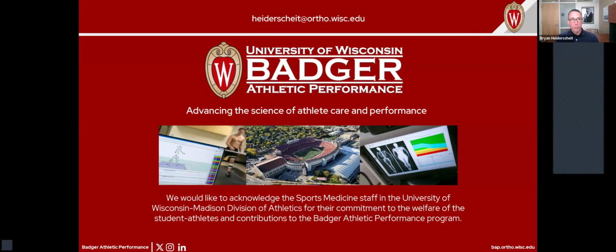So doing it for the deltoid ligament, I think, will be a little bit more of a challenge, just given the bony congruity to that region and oftentimes the challenges of getting a good stress test essentially performed to it. Not that it can't be, but it would be a little bit more challenging. I think the calcaneofibular ligament, for sure. I think that will work quite well.